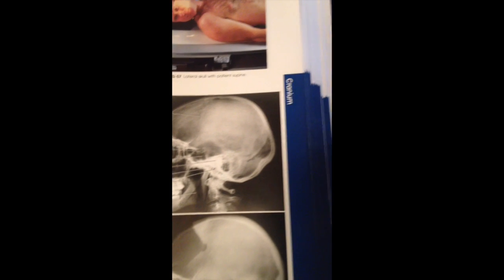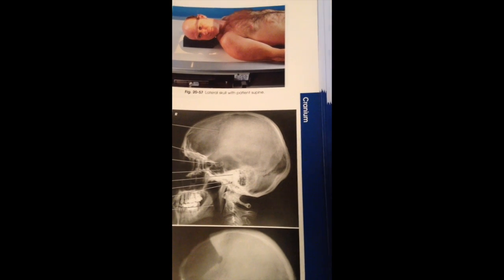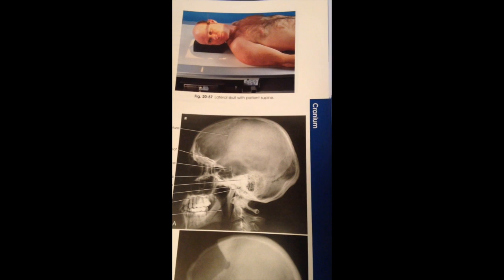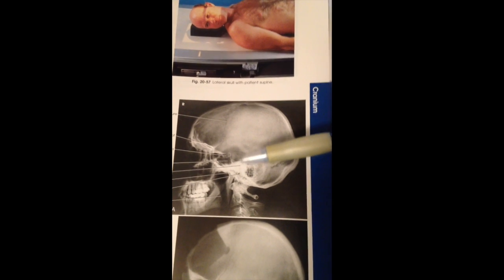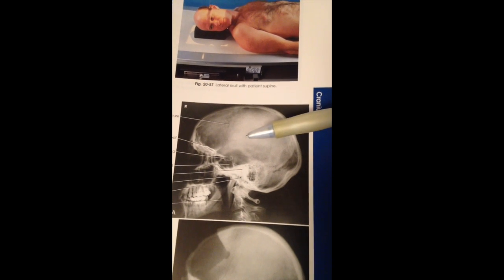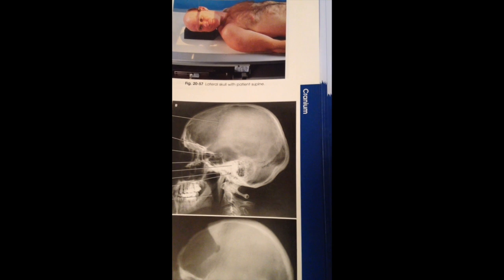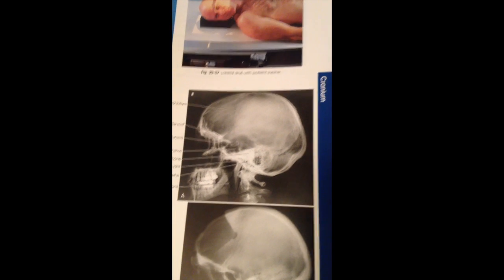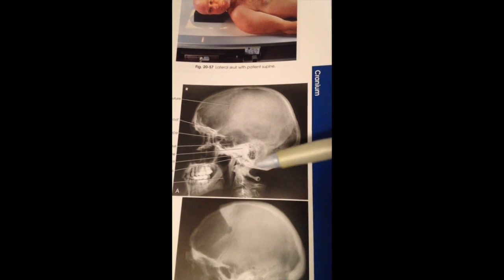And it shows superimposed TMJs as well as superimposed mastoid regions and the EAM. The central ray is 2 inches above the EAM, and it shows penetration of parietal regions, and there is no overlap of the cervical spine right here.